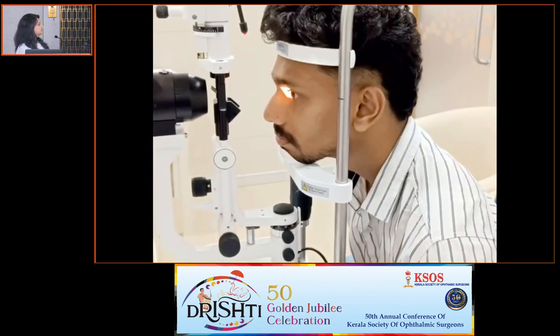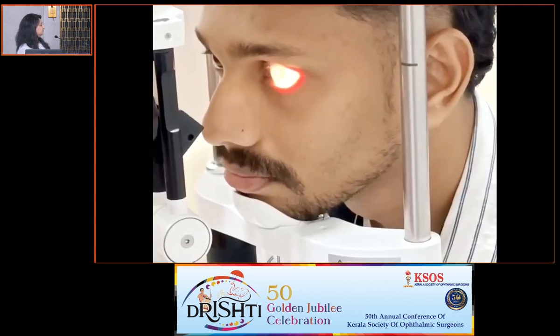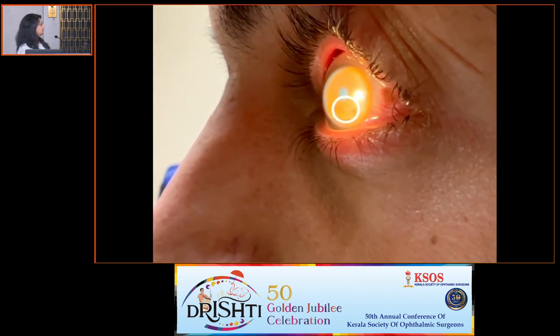Now the position of the patient is very important to make sure that proper evaluation is done. So once we locate the foreign body on the cornea, the work is not done.